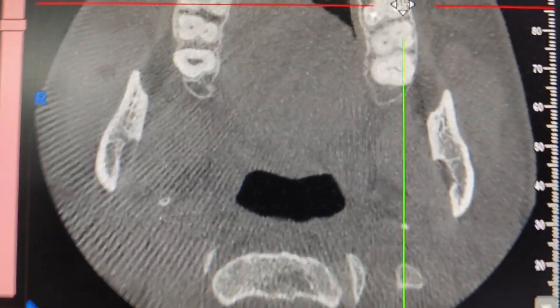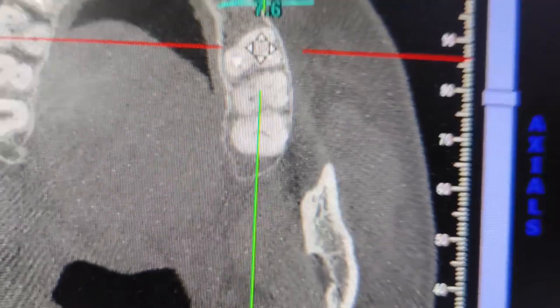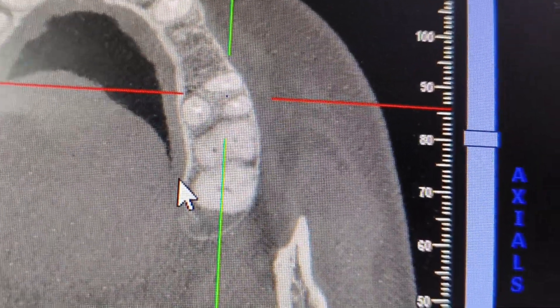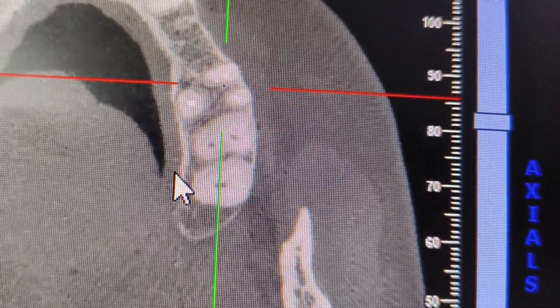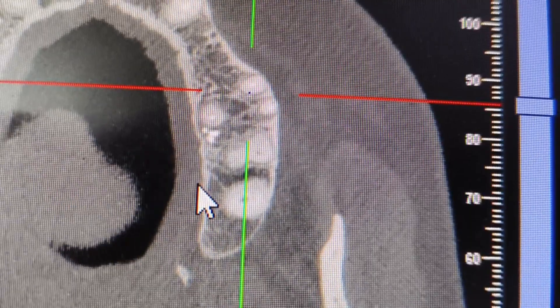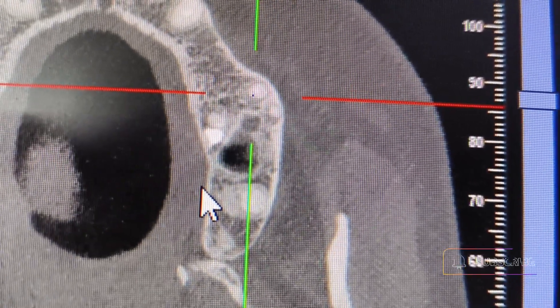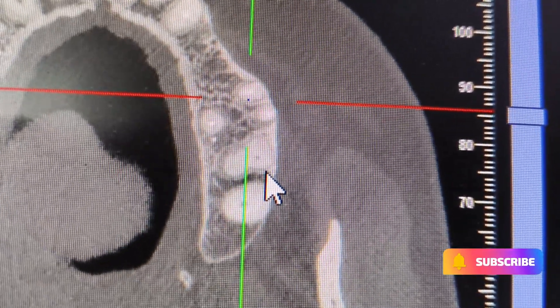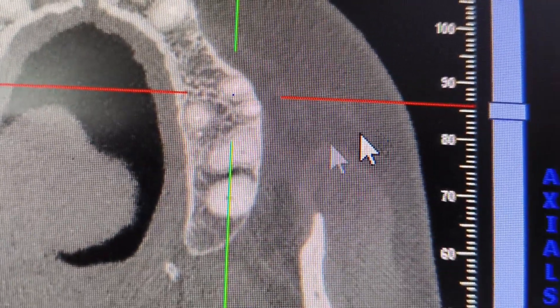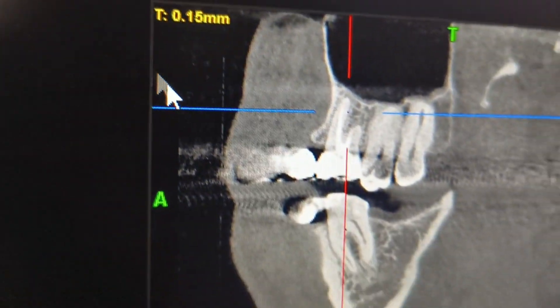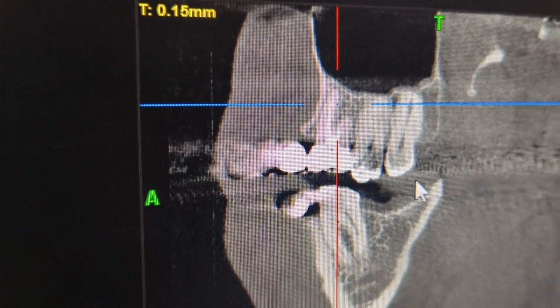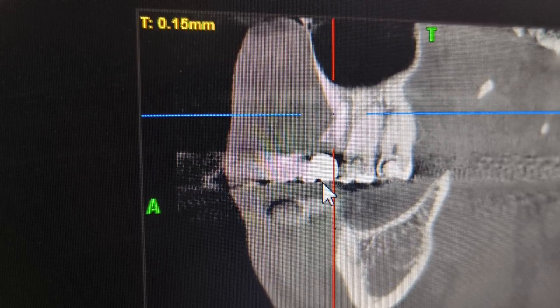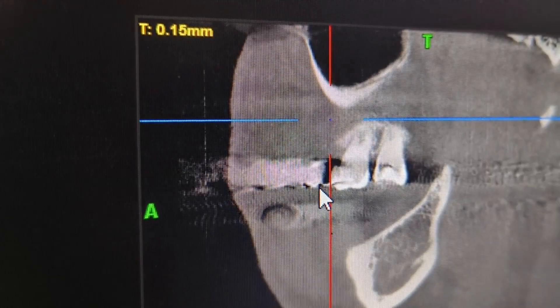If you want to see the root tip of this root canal treated tooth, you can just scroll to the root tip to check if there is any infection. The filling is very nice. You can see the same thing in this section — like an IOPA — and here you can see the palatal root separately.